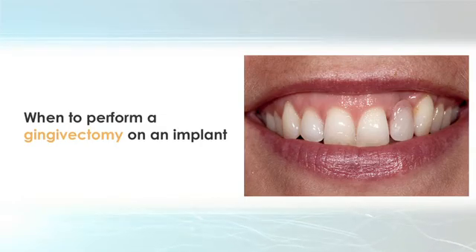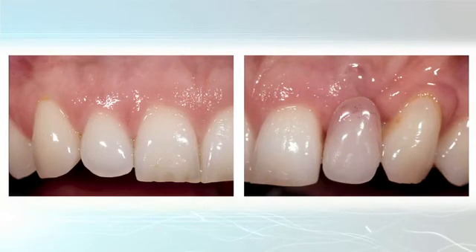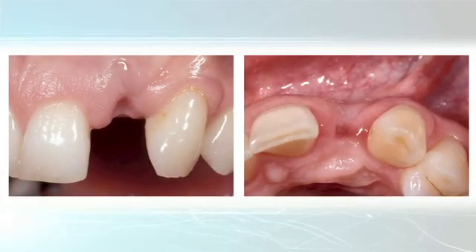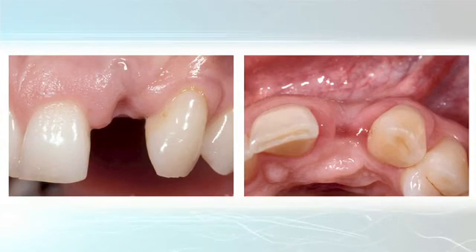Missing lateral incisor in a patient with a very high lip line. So we want the gingiva to be as ideal as possible. We go through all the steps I've just got done showing you. So here she was pre-treatment. She lost the lateral traumatically. Dave Matthews was the surgeon. He placed the fixture and he did a connective tissue graft.